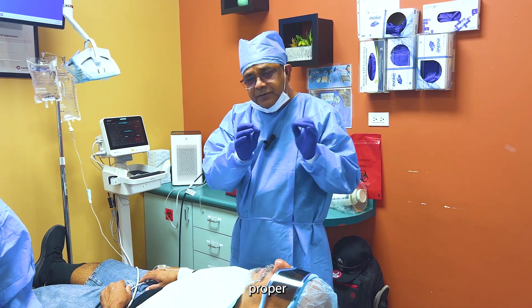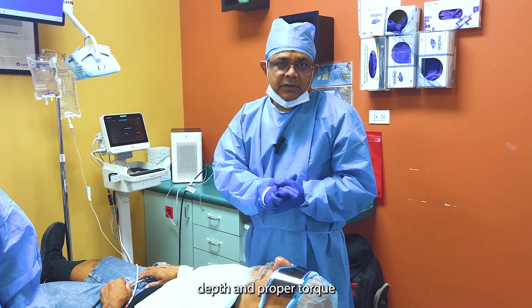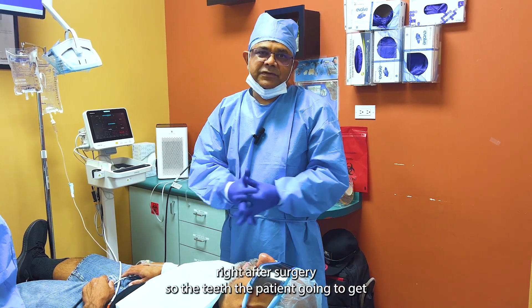Proper spread, proper angulation, proper depth, and proper torque — so the implants can be loaded and patients can have teeth right after surgery.